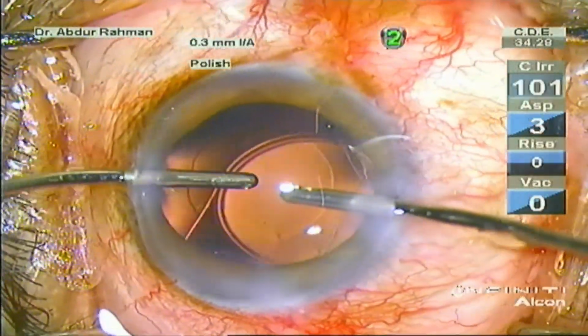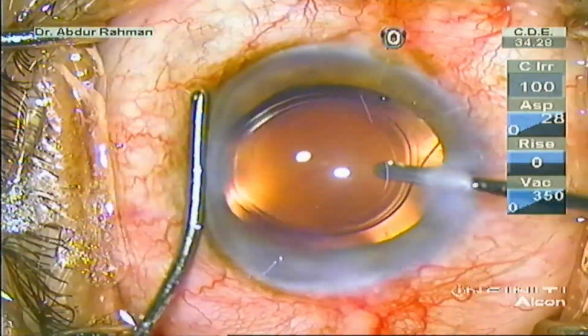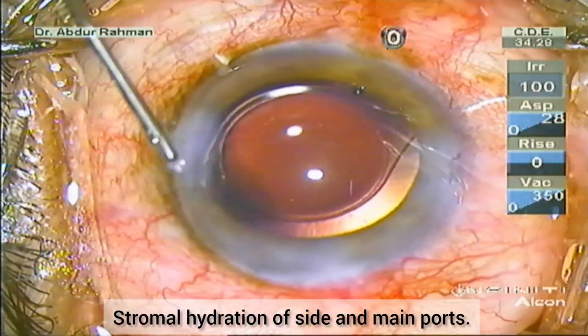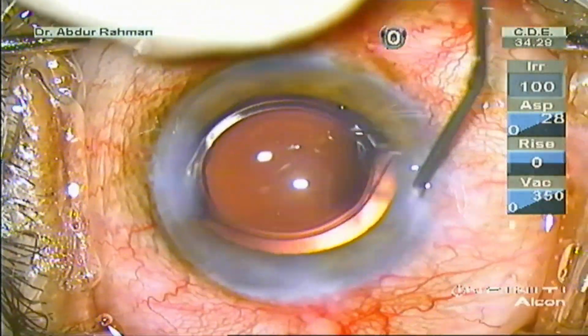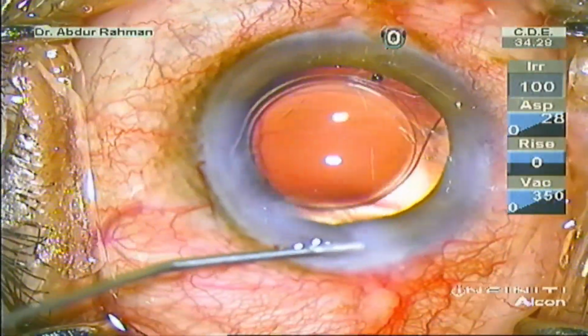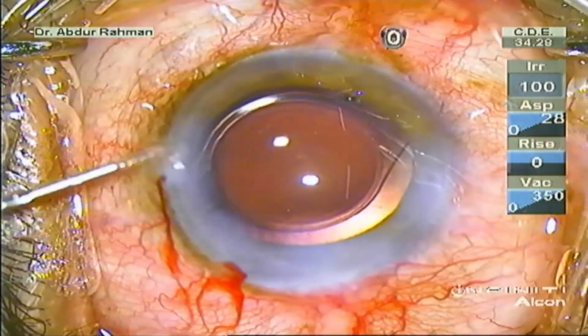Since I performed hydroimplantation, there was less visco in the eye. Only visco present was from the injecting cartridge of the IOL. Now perform stromal hydration and the case is completed after giving intracameral antibiotic and subconjunctival dexamethasone.